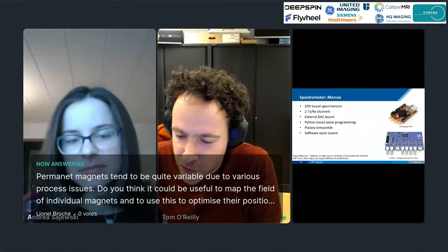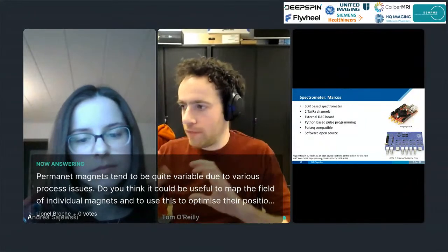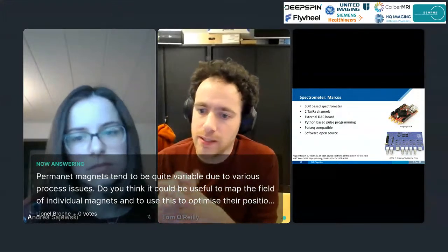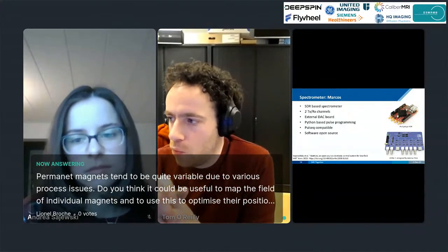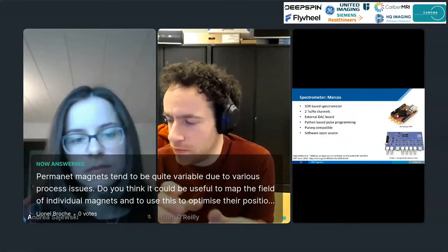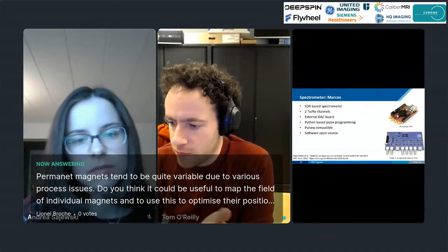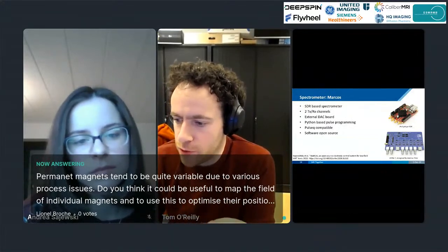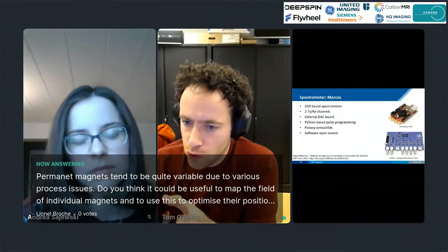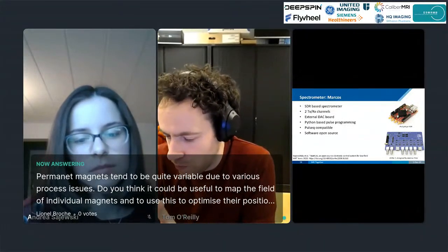One of the benefits of using 4,000 magnets is that you will average out some of the variance inside of the magnetic field just due to the sheer quantity of magnets that you have. But when you have certain set biases, like if you get magnets from 2 different batches, they will all have a standard deviation around an average, but that average will be different between batches. So if you can use all magnets from the same batch, that's the main thing to consider.